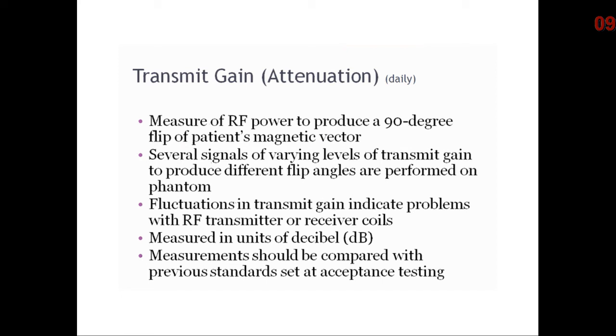Changes in transmit gain measurements should be compared with the standard set at acceptance testing, and if those levels are exceeded, they need to be reported to an MRI physicist or vendor engineer.